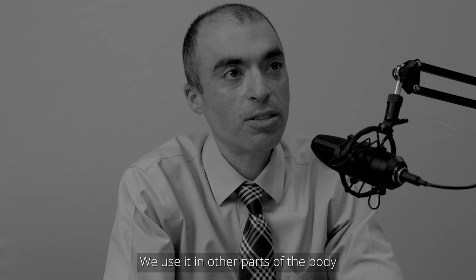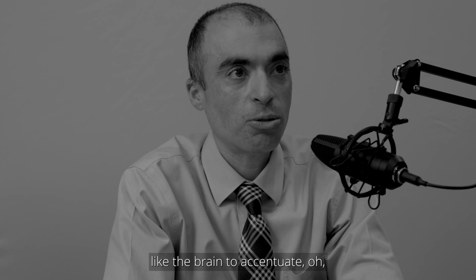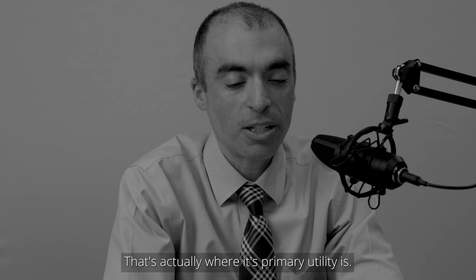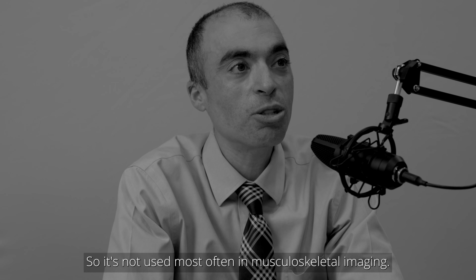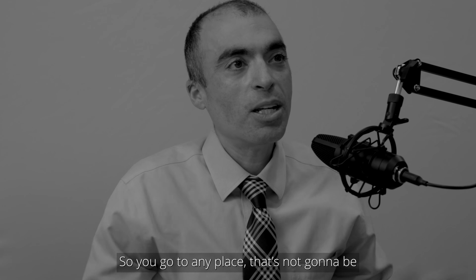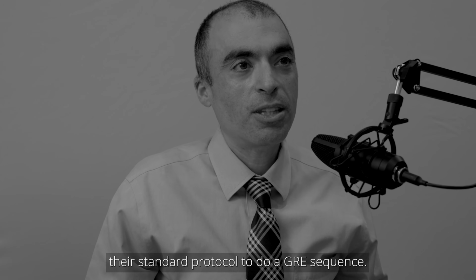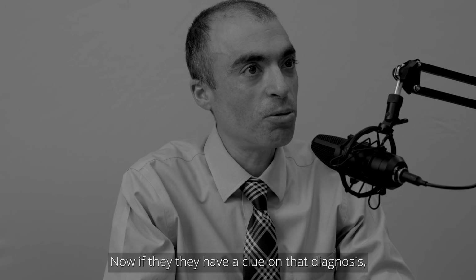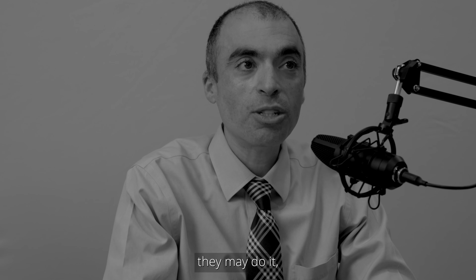We use it in other parts of the body, like the brain, to accentuate, oh, that person has an intracranial hemorrhage. That's actually where its primary utility is. So it's not used most often in musculoskeletal imaging. So you go to any place, and that's not going to be their standard protocol, to do a GRE sequence. Now, if they have a clue on that diagnosis, they may do it.